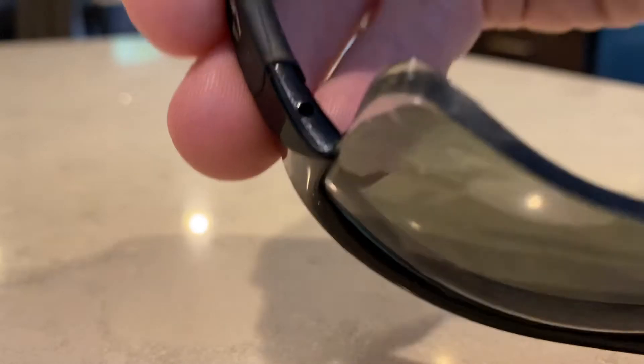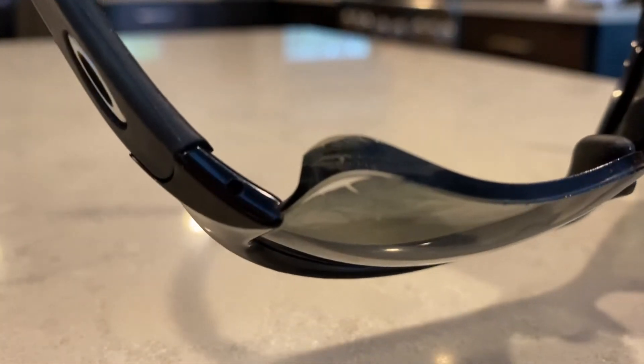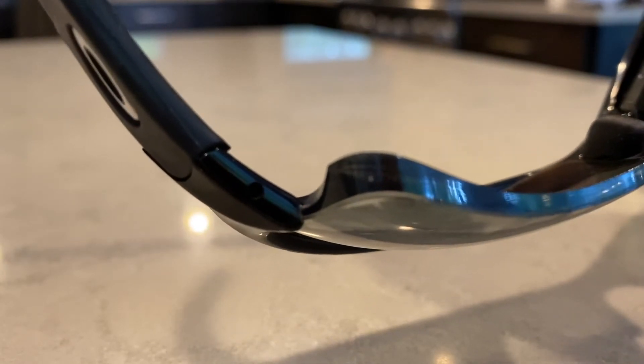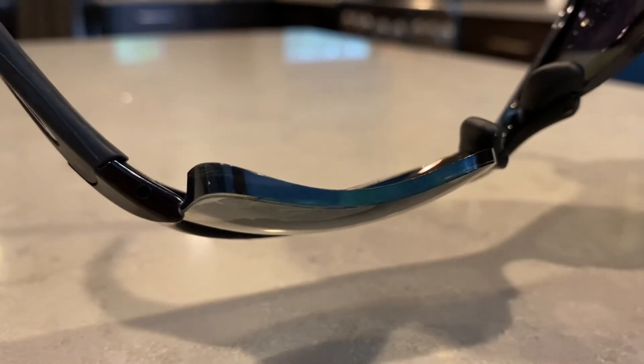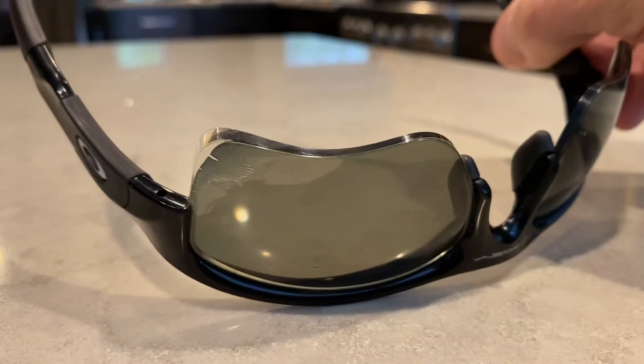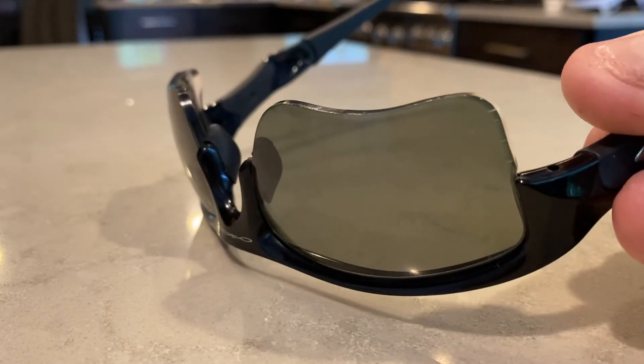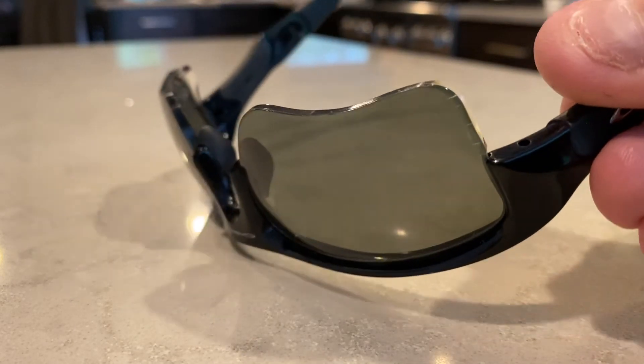They're not chipped, not scratched — they're in very good condition — except for the lenses coming apart. You can see the separation right there. And this lens over here is also starting to do the exact same thing.